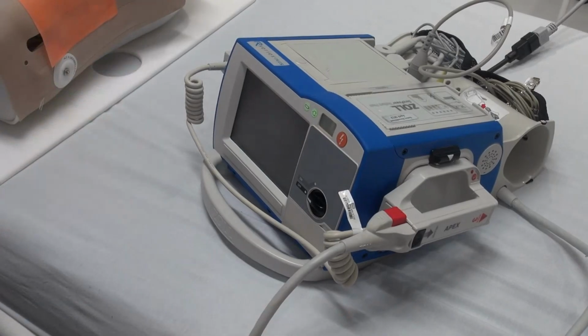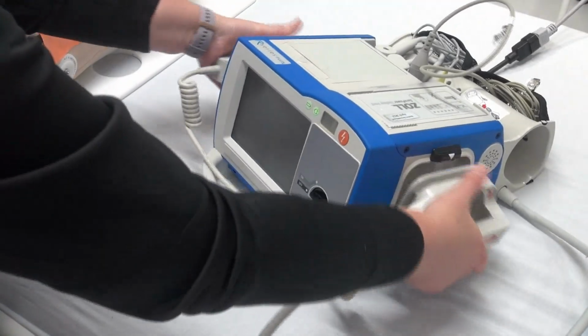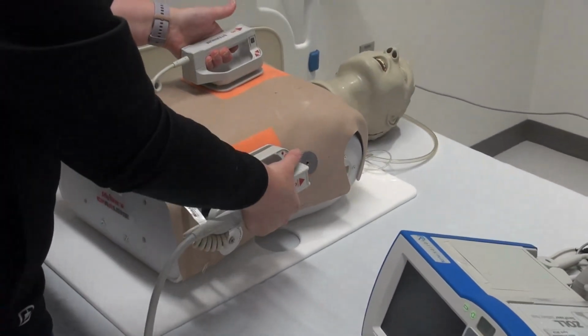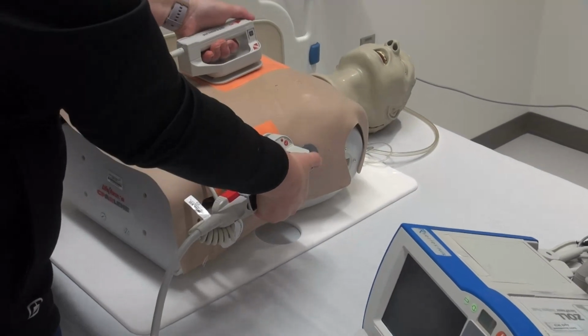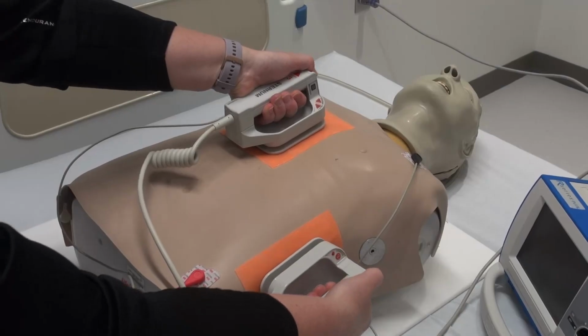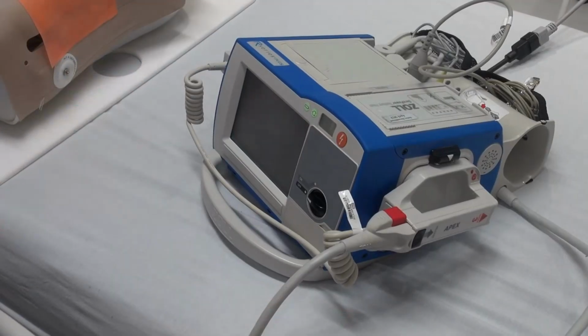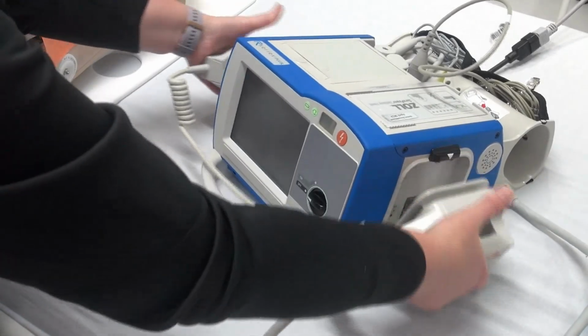To defibrillate, place the paddles over the gel pads and apply firm pressure. Press the charge button located on the apex paddle. Once charged and the patient safely cleared, administer the shock by simultaneously pressing and holding the shock buttons on both paddles. Between shocks, the paddle should be placed back on the Zoll. To release when needed, press down on the black arrows.